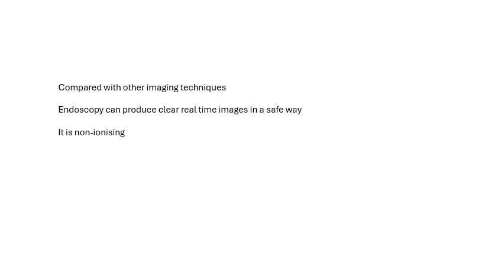We'll compare different techniques in a later video, but for now, compared with other imaging techniques, you get clear real-time images, and it's very, very safe. It's non-ionising, unlike X-rays and using radioactive isotopes.